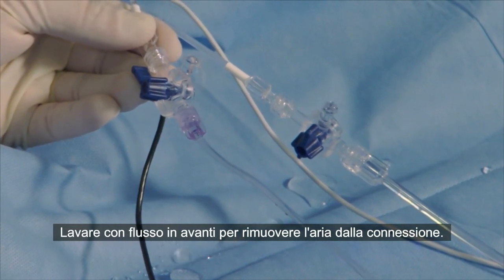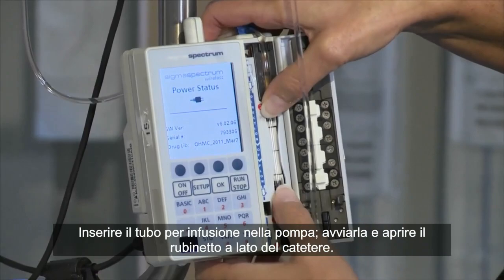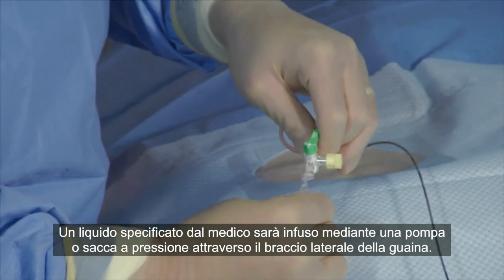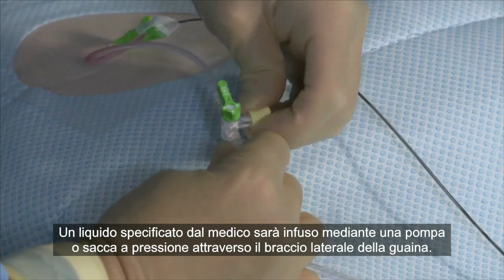Forward flush to remove air from the connection. Insert infusion tubing into the pump, start the pump, and turn the stopcock on to the catheter. A physician-specified fluid will be infused via pump or pressure bag through the sidearm of the sheath.